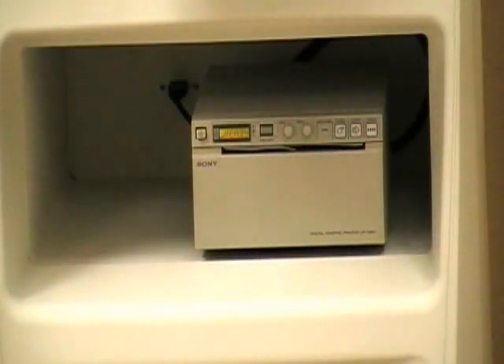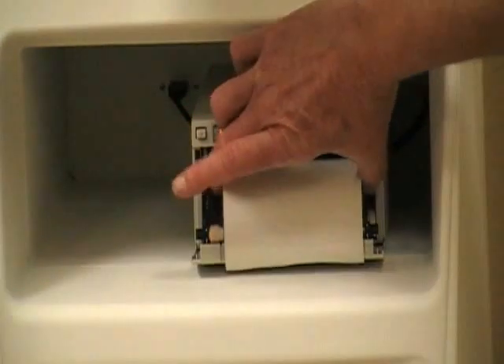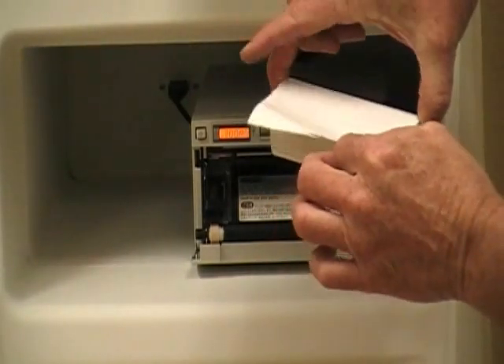Changing the paper in the printer: hit the Open button, the door will open up, take out the roll, get a new roll. The paper comes over the top like this, just like your toilet paper at home.